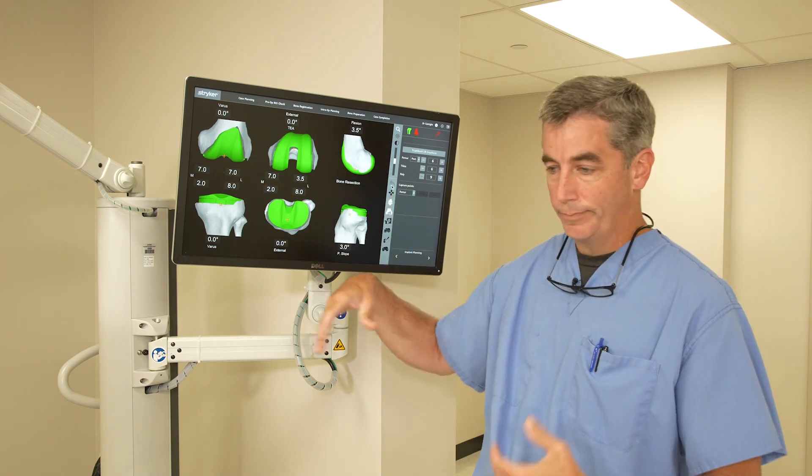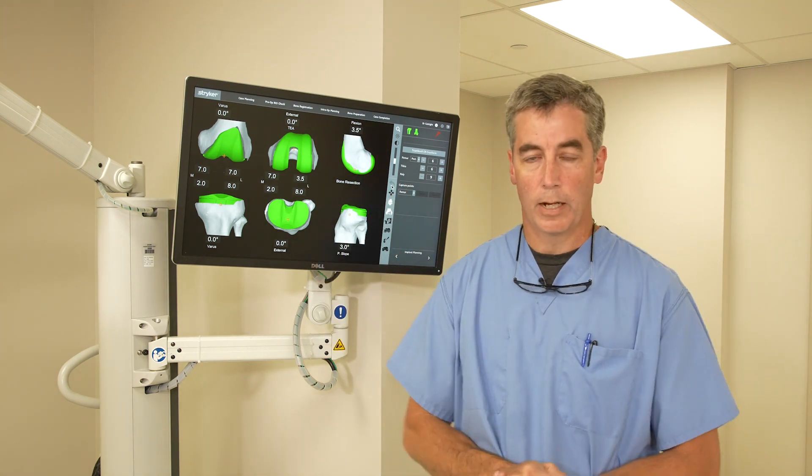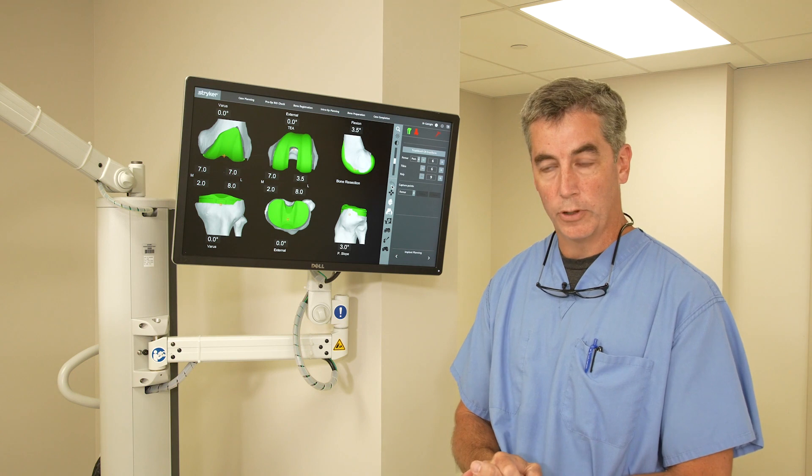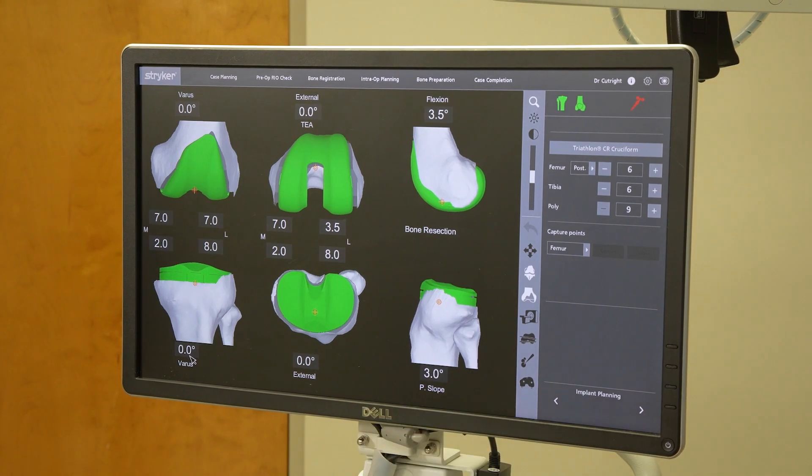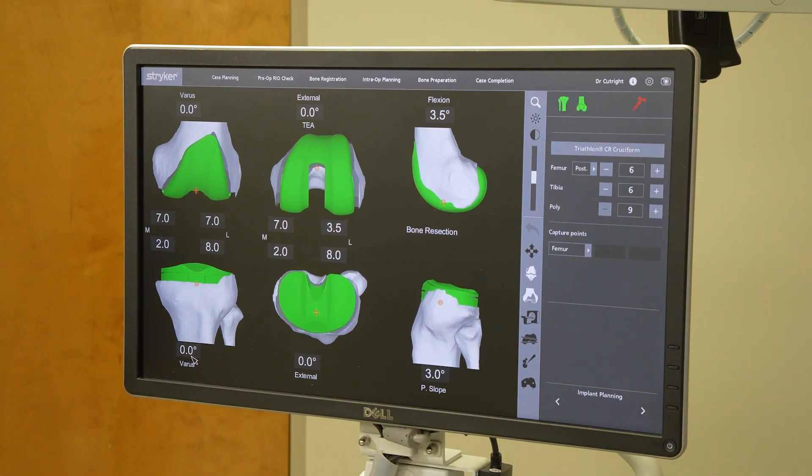So once we've done that, the patient comes in and we get them ready for surgery. Next I want to show you the components of the robot. This is the computer where the rep controls the robot — which part of the surgery we're working on, which cuts of the bone we're working on, and that sort of thing.